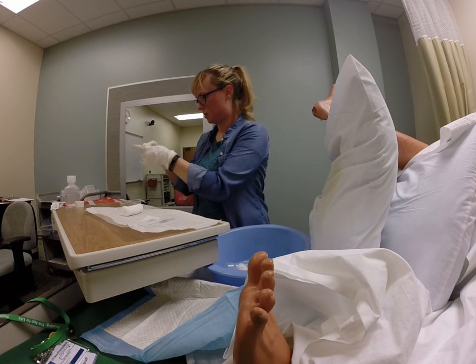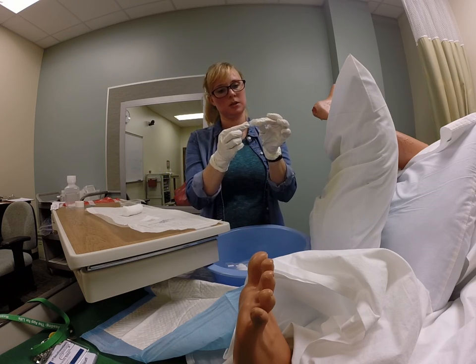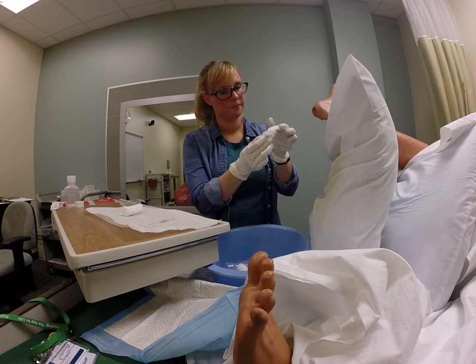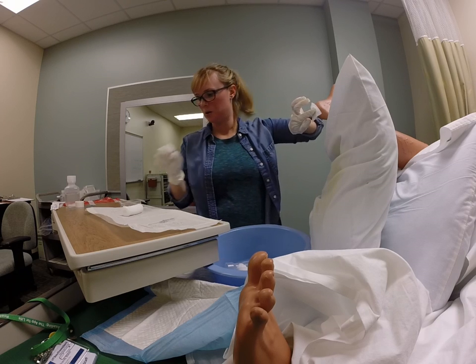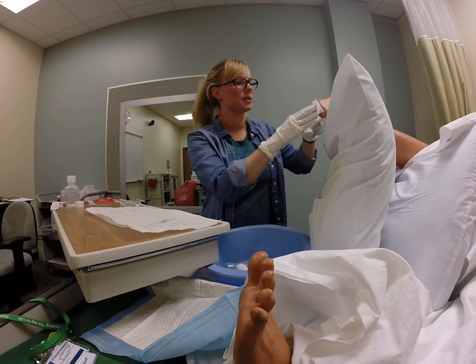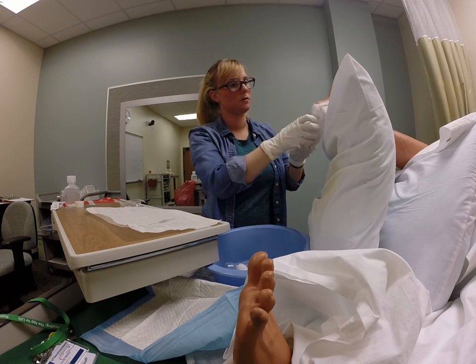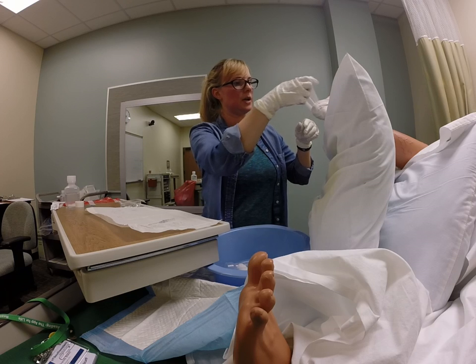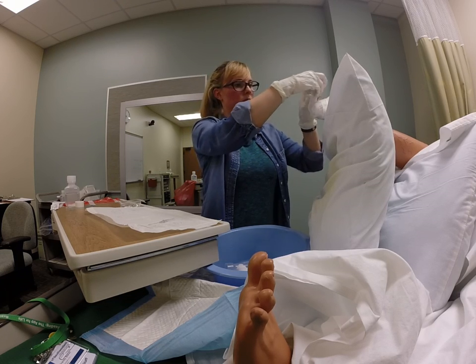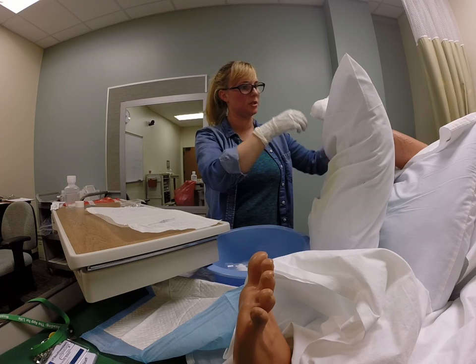2 packing. 1 is going to go in my water and get nice and wet. And then I'm going to make a little round oval disc. My dry gauze is going to go over the top of that. And I'm just going to put it in there. Hold it on, while I get my gauze roll or my conforming gauze and wrap this thing. No special procedure on wrapping. People usually do 8s. Alright, so that's it.